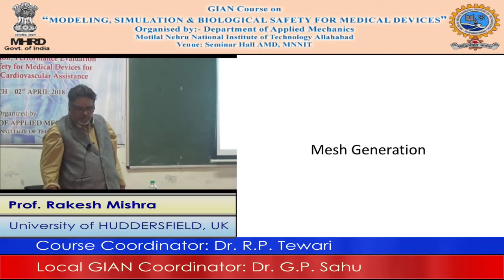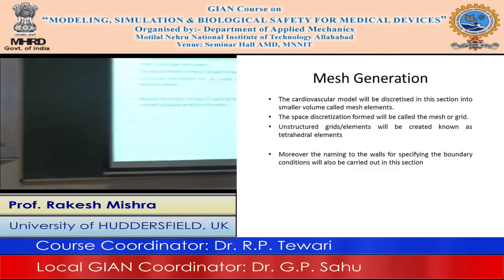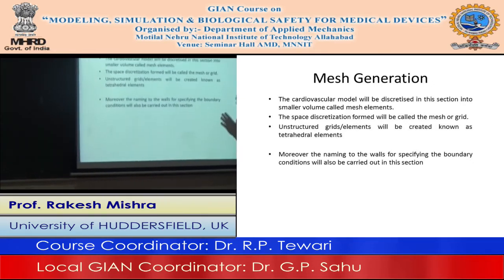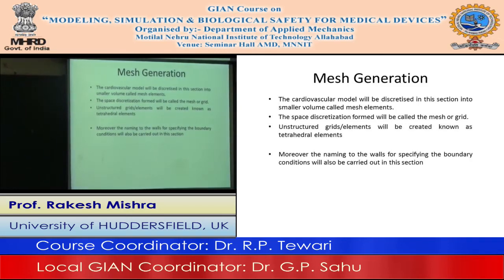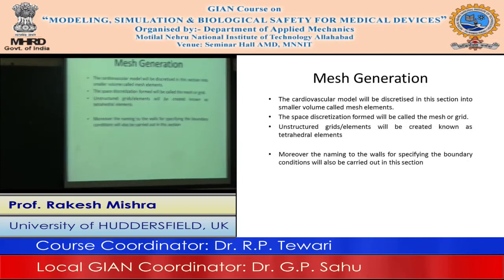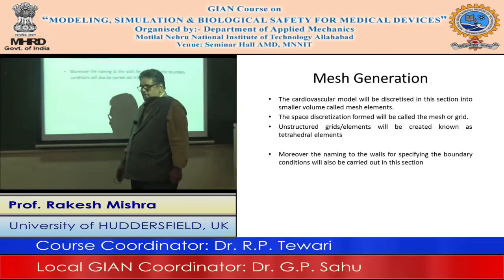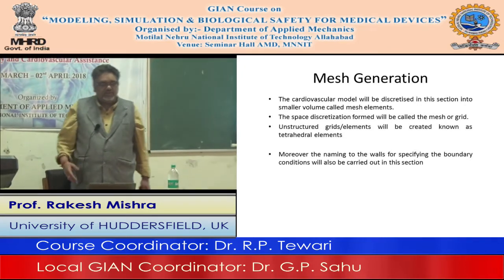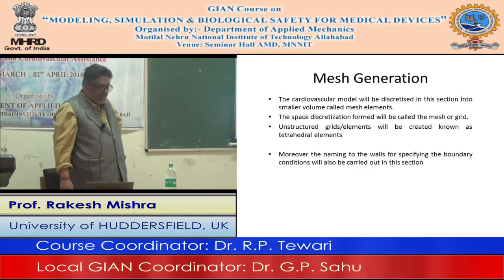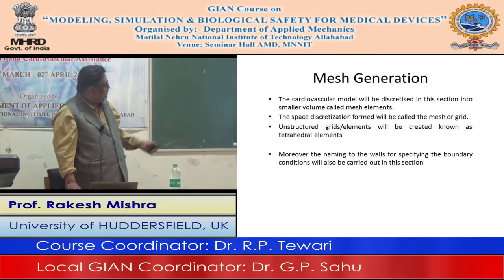So let us go for mesh generation now. Once the stent has been created, what I am doing is I am creating a mesh and I am giving the boundary conditions corresponding to the mesh. So we will discretize the entire flow domain into smaller volumes called mesh elements. Then we carry out the space discretization. We will create grids. In this case, we will create tetrahedral elements, although hexahedral are best, but it is easier to create tetrahedral elements. And then we will name the walls and we will supply the boundary conditions in this particular case.